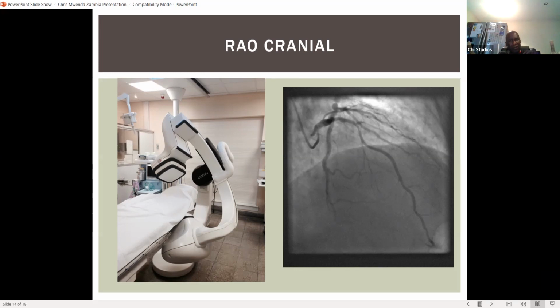How we put a stent is we go from the healthy portion to another healthy portion, so from here up to here. Because if you stent here, then this part will remain, so it will affect the patient in the future. So if you need to stent, you go from health to health, from here up to somewhere here. That would be a long stent. We usually have these stents in our store.